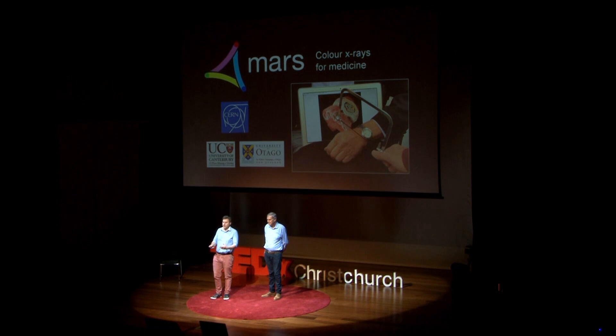What would happen if I could see inside my father's wrist and measure the calcium, the fat and the water, all without having to use a saw?